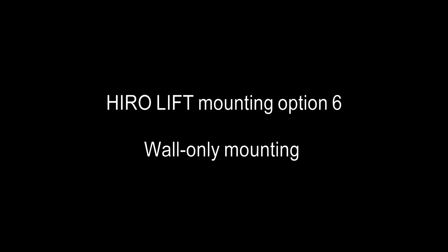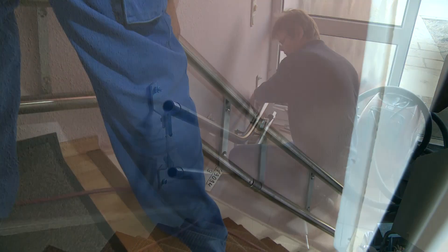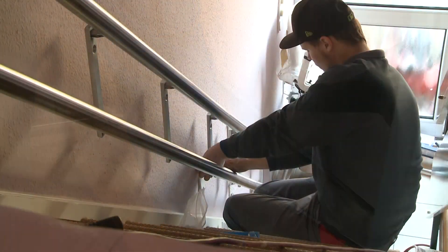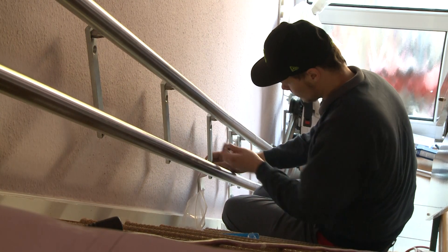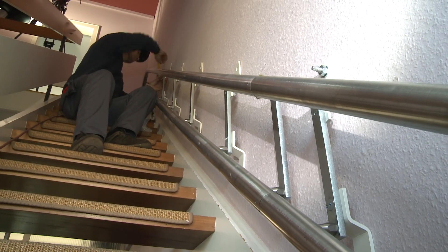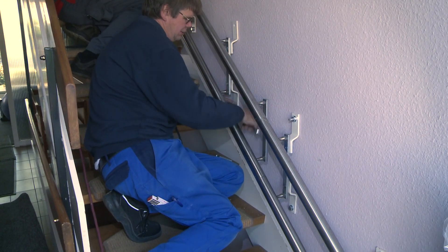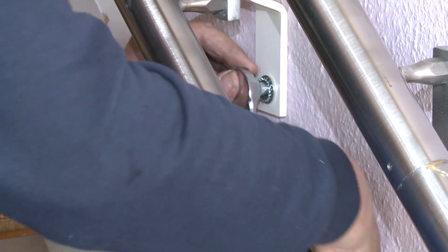Hero Lift mounting option six: wall only mounting. If the masonry is suitable, wall only mounting can also be considered. This solution has no contact with the staircase whatsoever.